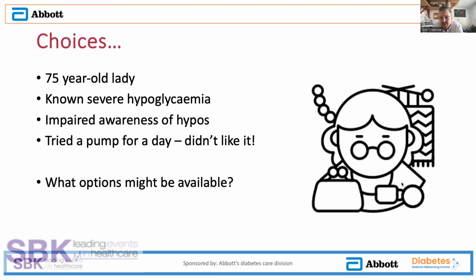She tried a pump for a day. She left the pump stop. She went and got a chippy tea. Her blood sugars hit 11, and she went, "This isn't working for me." Took it off and went straight back to injections.